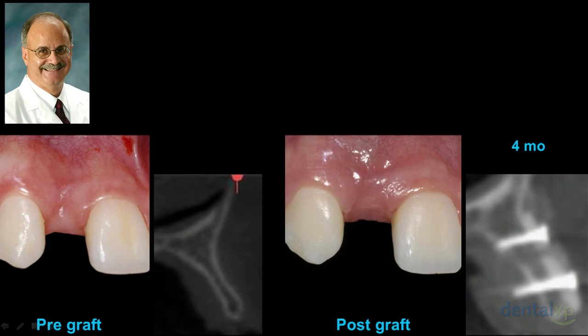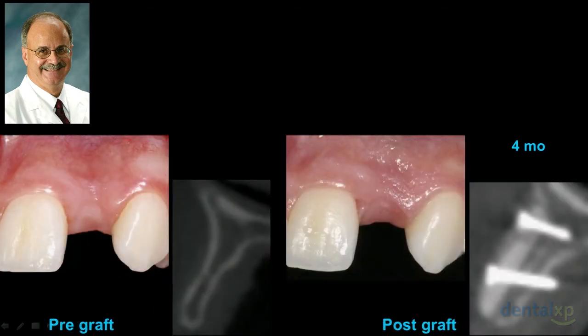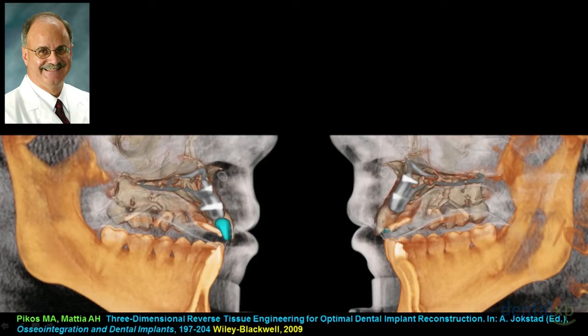So the long and short of it is we have a combination of tissue engineering and autogenous bone grafting combined. And the value of a post-graft scan, whether we're sinus grafting, socket grafting, ridge splitting, particulate mesh grafting, whatever the case may be, no guesswork. Who wants to be surprised when you re-enter? Not me. So we can post-graft scan and know exactly, did we hit the bullseye? Is the bone good? Is the density adequate? Did we have any resorption? And if so, was it too much to preclude implant placement?